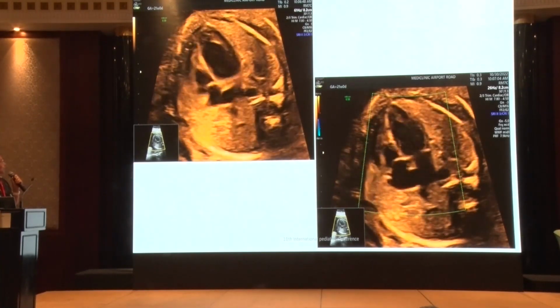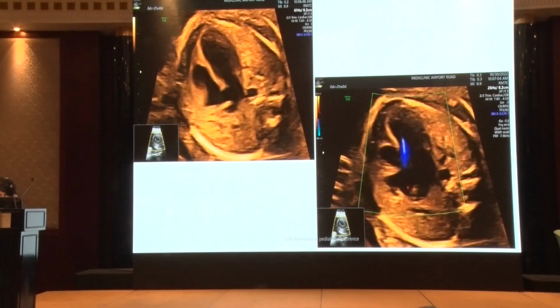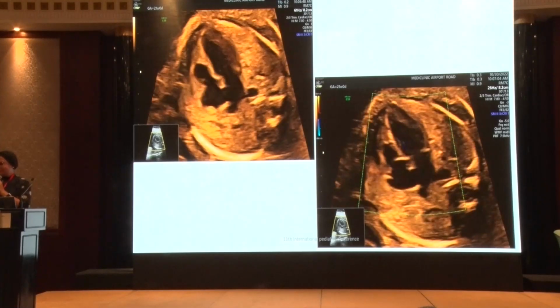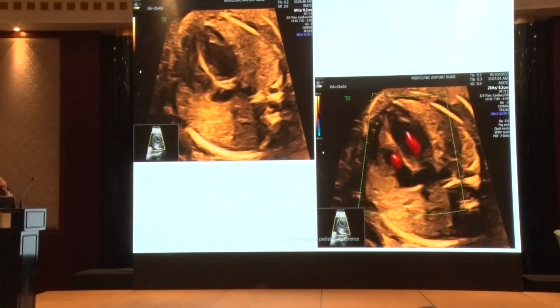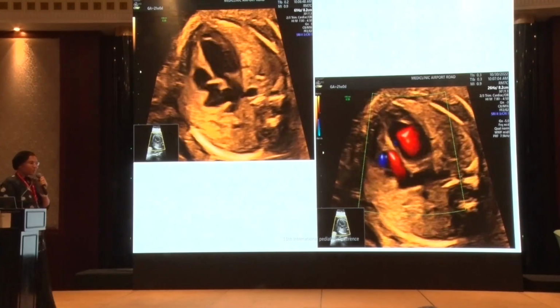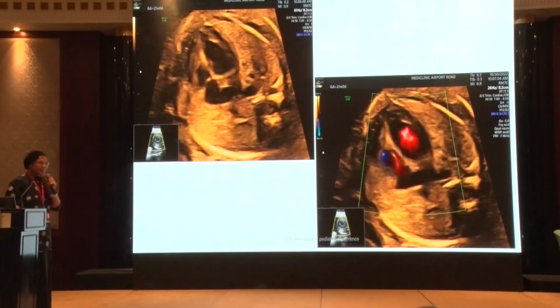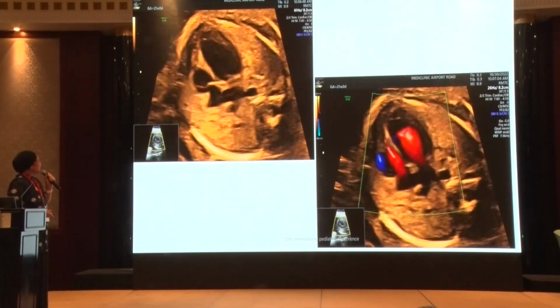More or less, it is normal, we could call it. Any comment? Dr. Diana? It looks relatively normal, yeah? On the right side, yeah? On the left side, okay.